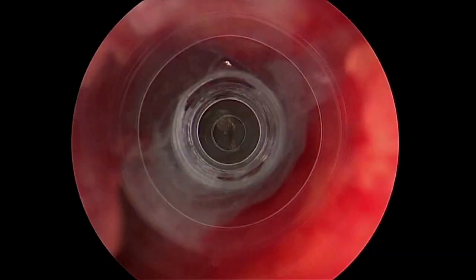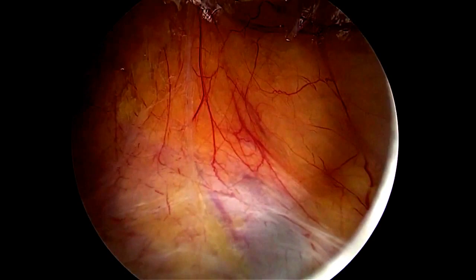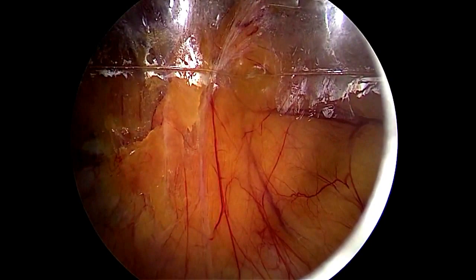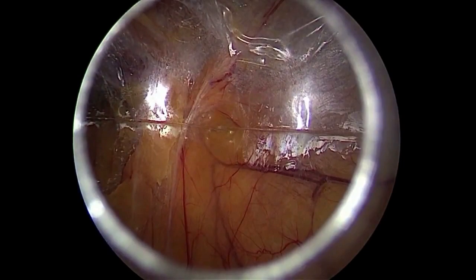Now I try to dissect the retroperitoneal space with the balloon. Obviously, after finger guidance, I introduce my trocar and I am dissecting the space. This one is very clear. The technique that I use is the same that I used in the past for radical prostatectomy. This is the balloon. It's like a bean, an ovoidal balloon. It's a little bit different in comparison to the balloon that I use for a retroperitoneoscopic approach, as you can see.